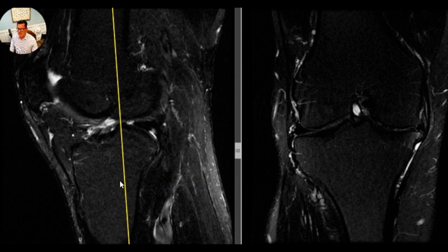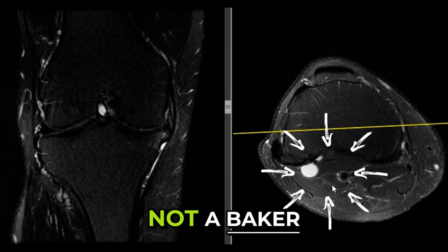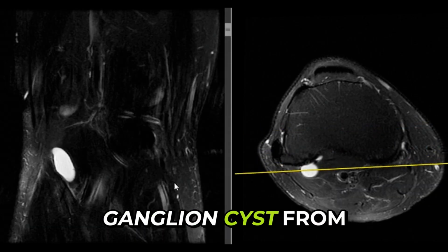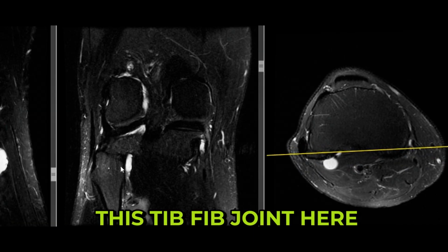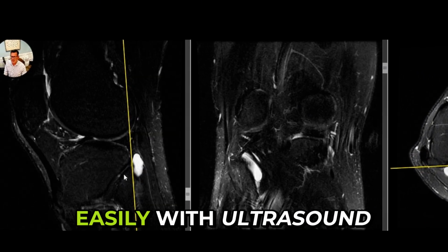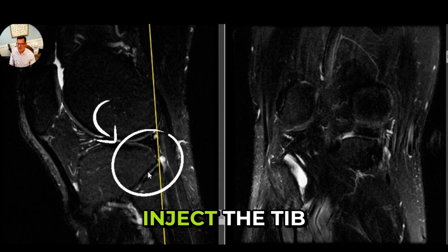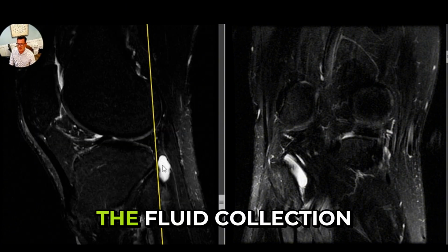Then the only other thing we saw in him was this kind of Baker cyst, but it's really not a Baker cyst. It's actually a ganglion cyst from the tib-fib joint. So it's coming off of this tib-fib joint here, and we could see that pretty easily with ultrasound. So I told him I wanted to drain that and then also inject the tib-fib joint, since that probably is the source of the fluid collection there.